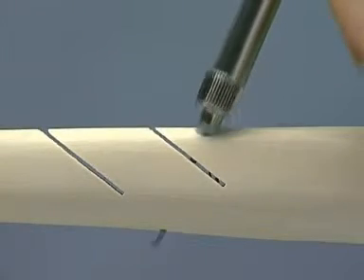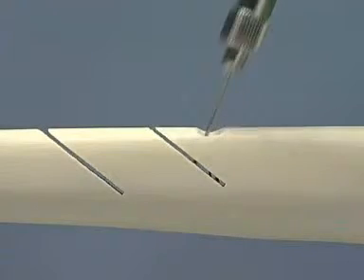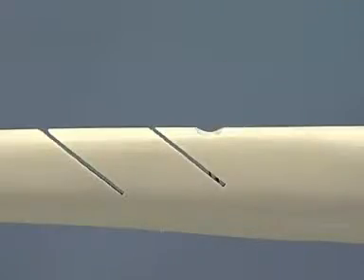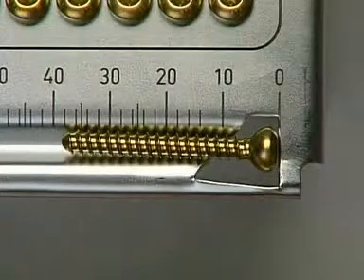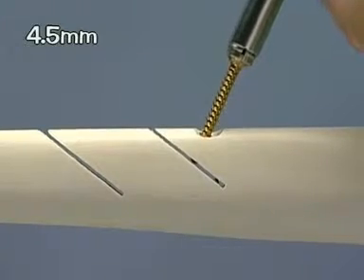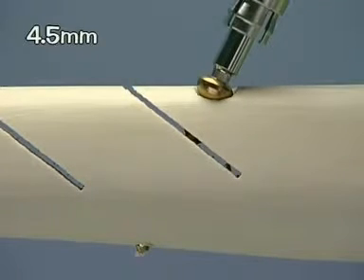Measure the depth. The depth of the hole is indicated on the scale. Tap the hole with the 4.5 mm tap and corresponding sleeve. The appropriate cortex screw is chosen, in this case 38 millimeters, and the length is checked. Insert the screw and tighten it. As the screw head comes into contact with the proximal cortex, the gap starts to close.